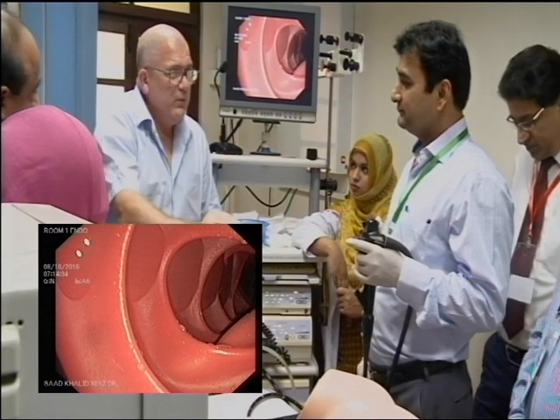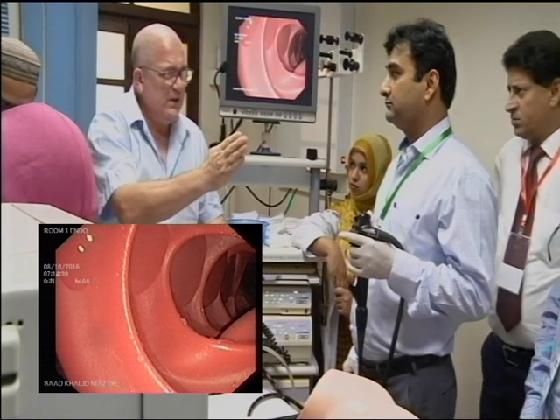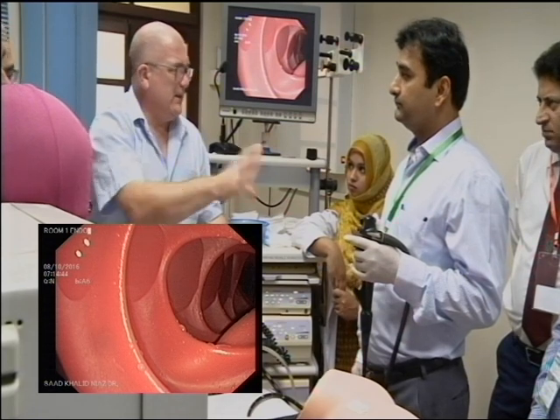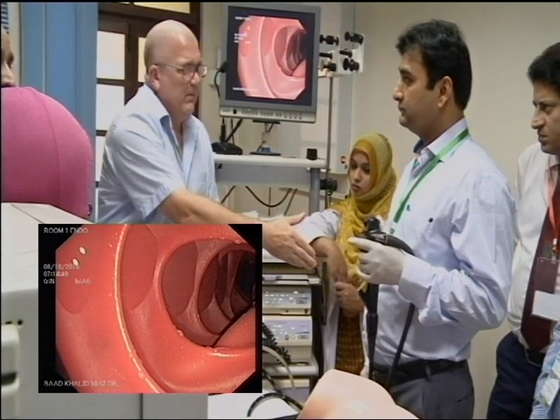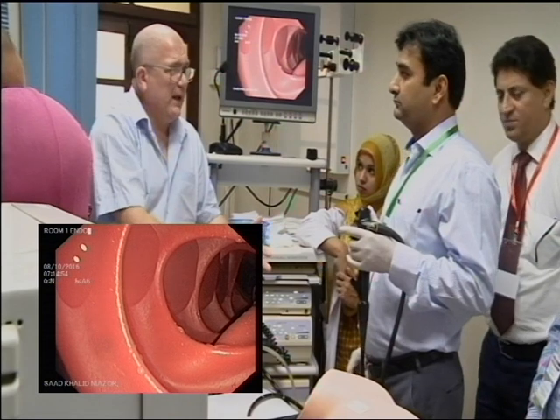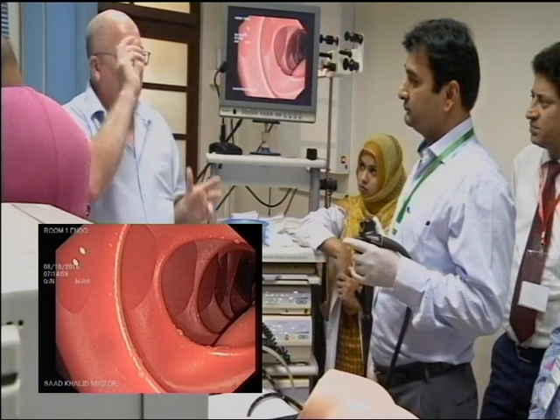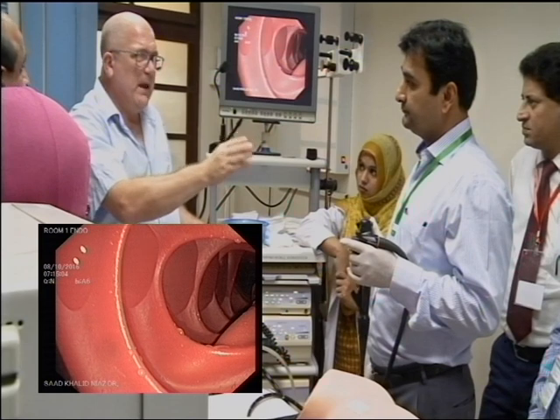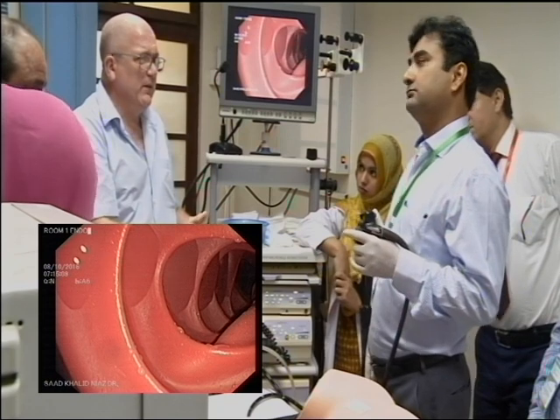Right? You slowed down, you were able to progress, you were able to do the things that you needed to do. So you know what to do. You were just throwing it at it just to see if that would work. Slow down. So the things that we need to look at are getting you to slow down. You know how to apply it, getting you to relax the grip. What we want you to do is have a relaxed grip, slow down, and be able to reproduce the moves and the maneuvers that are necessary to make you successful.